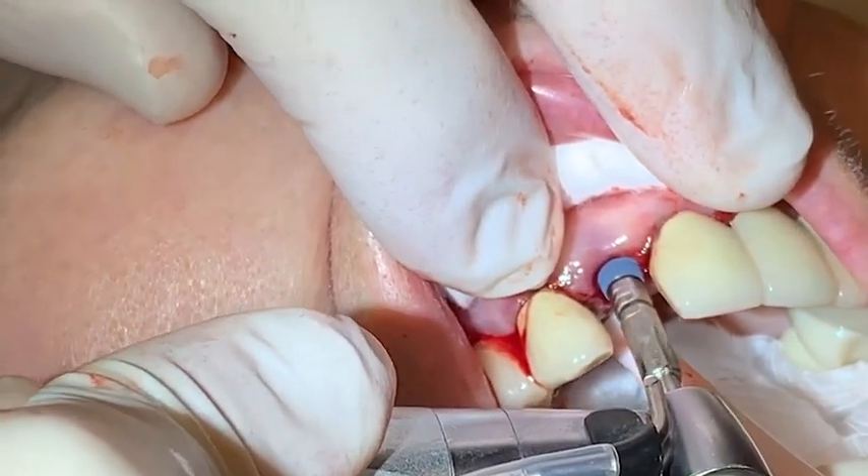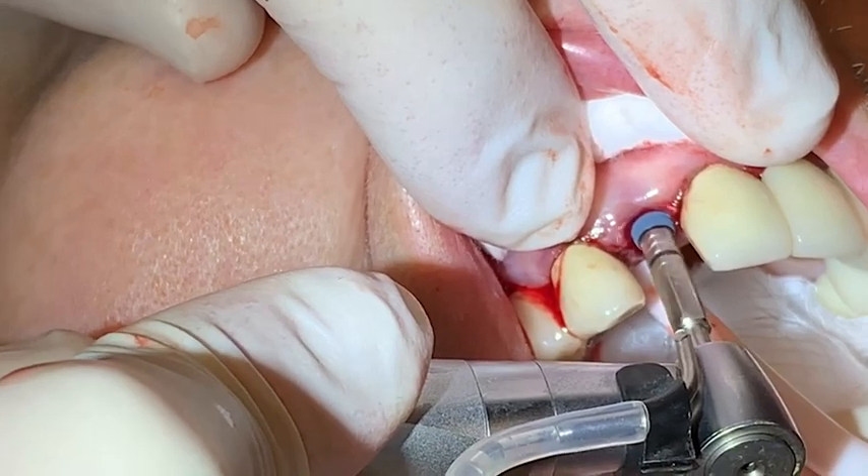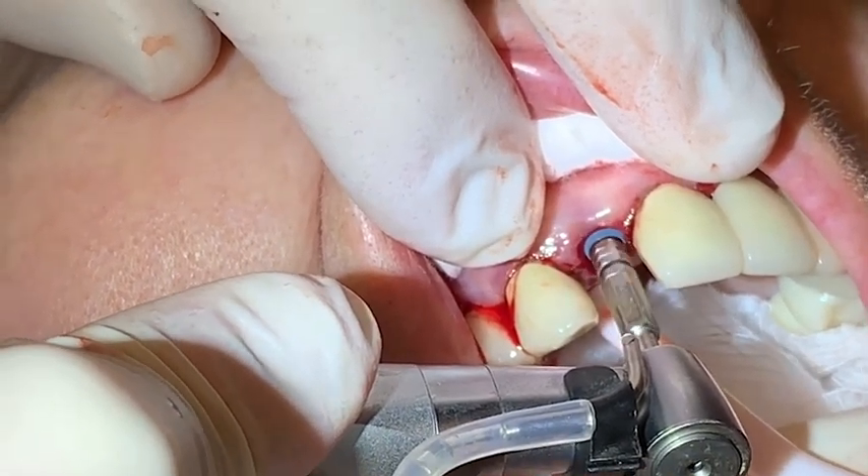The implant was placed and went apically until the black line, which is a measurement of three millimeters, became even with the crest of the gingiva.